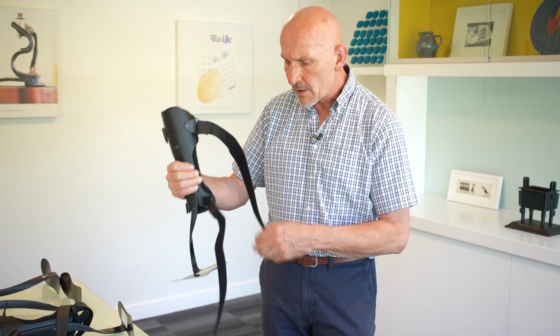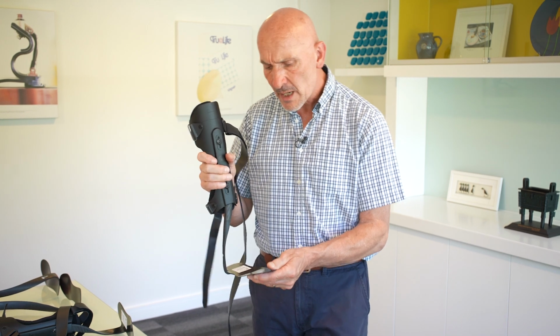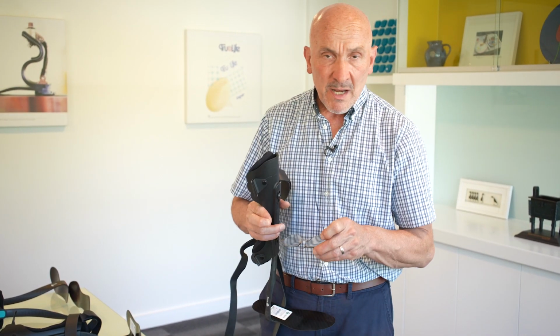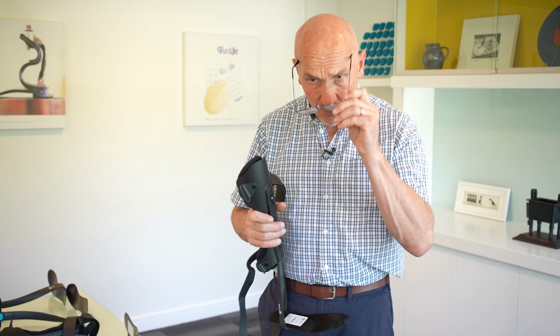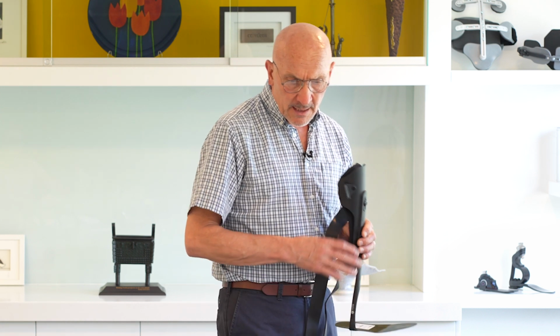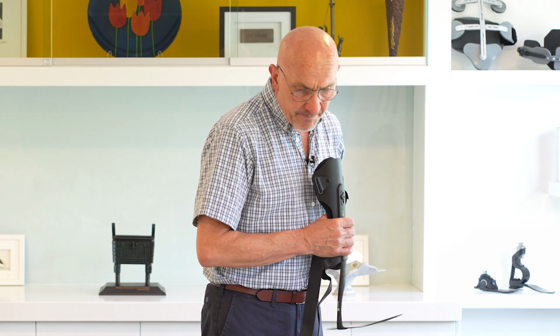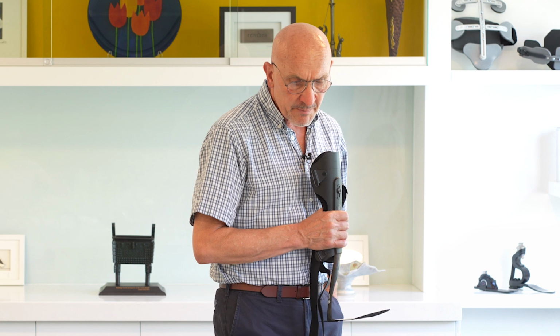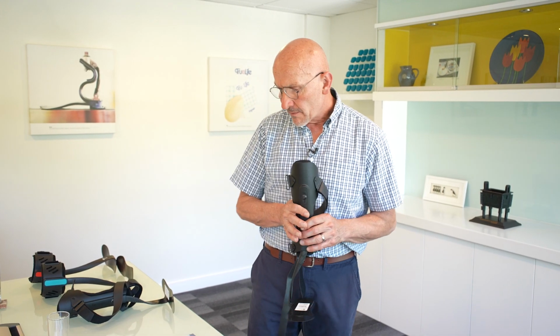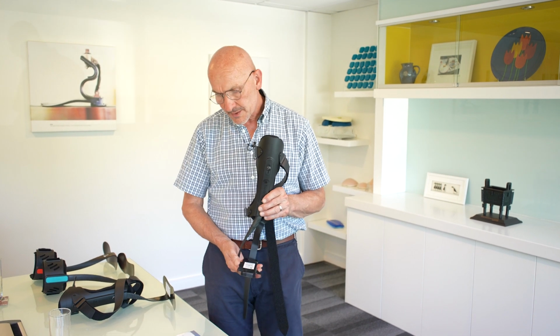The brace itself is for dynamic drop foot. Now this can be for many reasons, that you're wanting to give some stability and dynamic lift. We can have stroke, MS, post-polio syndrome, muscular dystrophy, spinal cord injuries, cerebral palsy. We frequently utilise these in clinic for all these reasons.